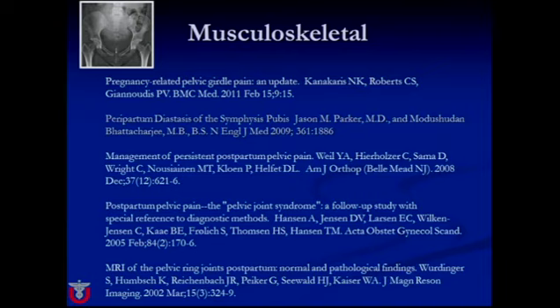Last but not least, if you see these women and you've evaluated everything you can evaluate with ultrasound and you still can't find anything, remember, there is myofascial pain and orthopedic causes of pain, and the patients may be very helped by a course of physical therapy. And as we move towards using ultrasound more for musculoskeletal evaluation, there may be things that we will look for using our linear transducers and approaching some of the bony structures in addition to the uterus and ovaries.